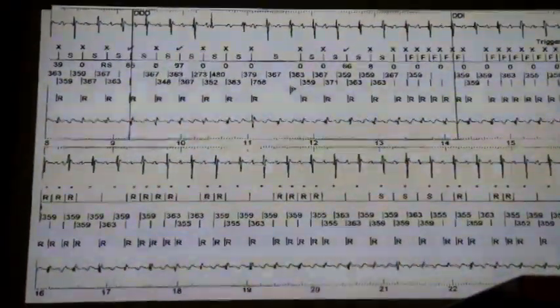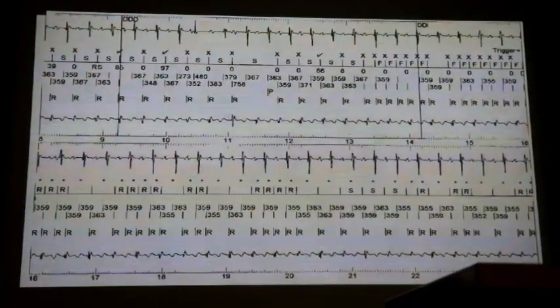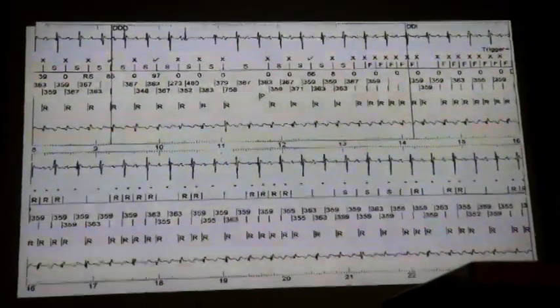We were worried about this guy. We thought, what should we do? So he was in clinic, not T wave oversensing. He's at 4, T waves are fine. So only exercise with the... Exactly. Put him on a treadmill.